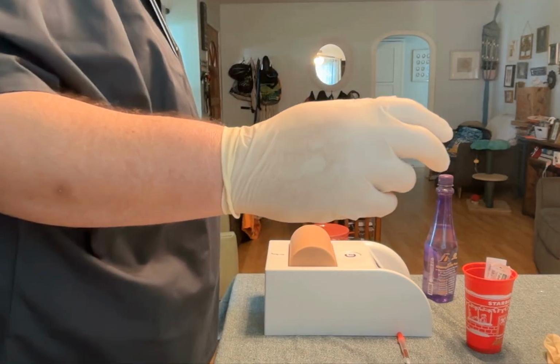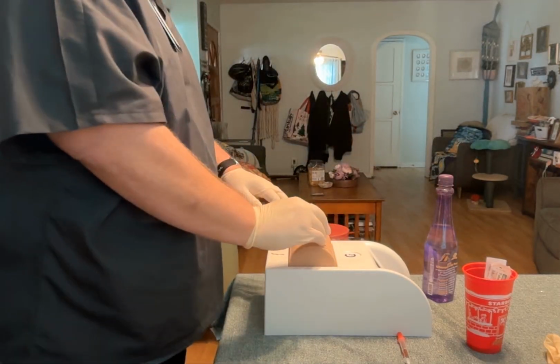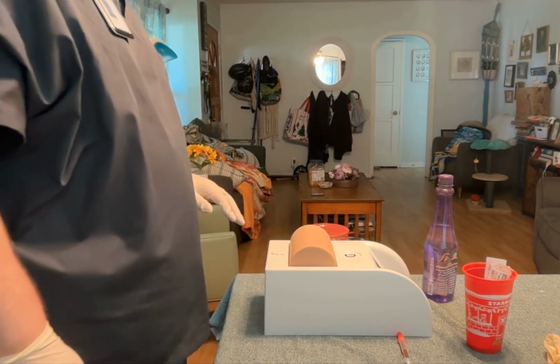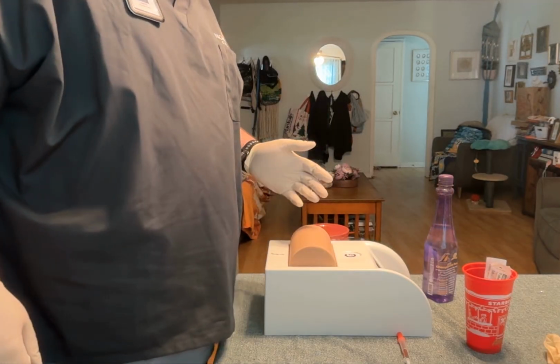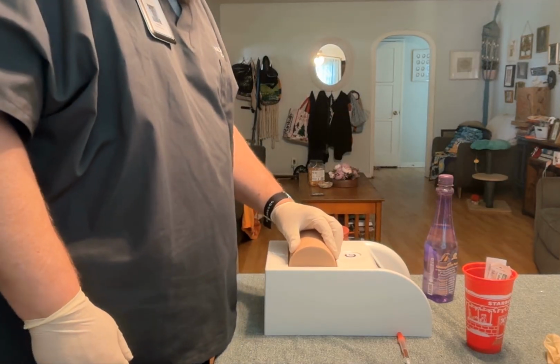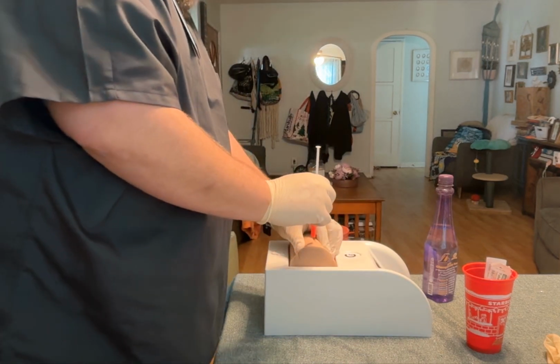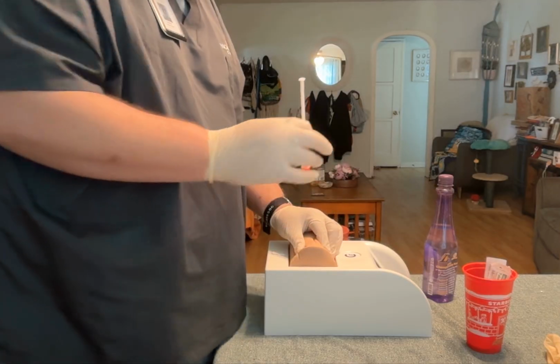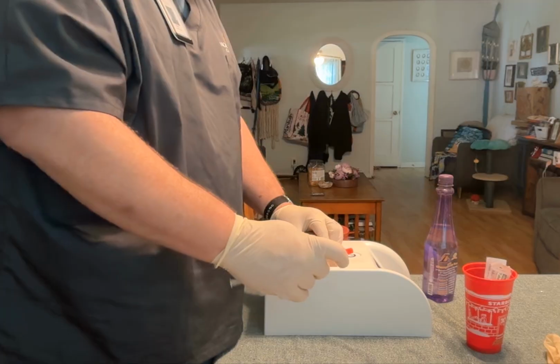I'm going to now take a fresh alcohol pad. I'm going to wipe from in to out about 5 centimeters. I'm going to let that dry. While it's dry, I talk to the patient and make sure she's comfortable. Okay, now that the site is dried, I'm going to pinch the site about 1 inch or so. I'm going to measure and see that I have enough skin and tissue that my needle will go into the subcutaneous area. It does.